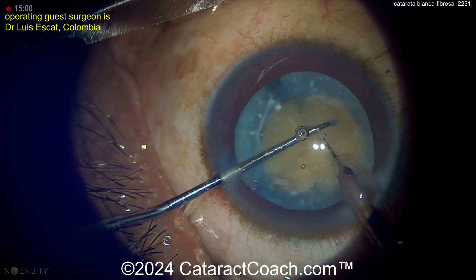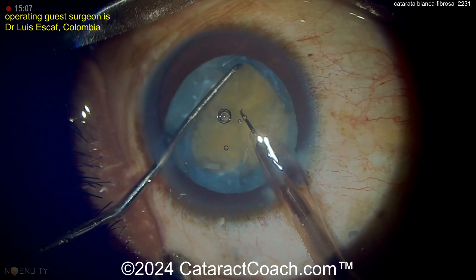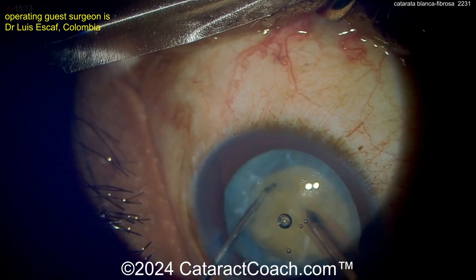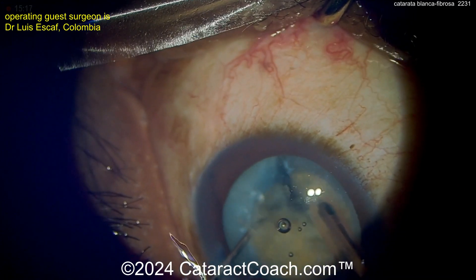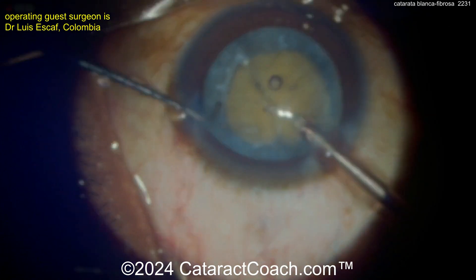By using this ultra-chopper, you're really able to get into this dense nucleus. You're using the ultrasonic power of your phaco tip, and this ultra-chopper is a sharp instrument. Notice it doesn't do any aspiration — your goal here is just to split the nucleus. You're not going to aspirate out the quadrants with this tip. You're going to switch tips after you've broken the nucleus into multiple pieces.